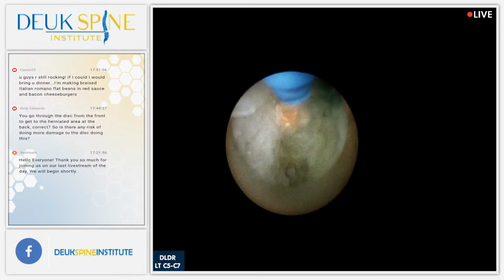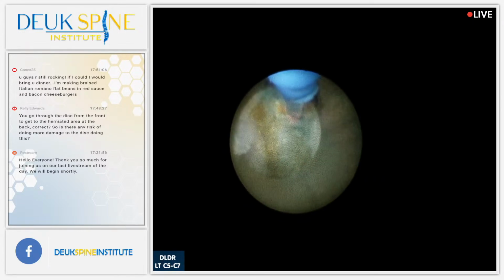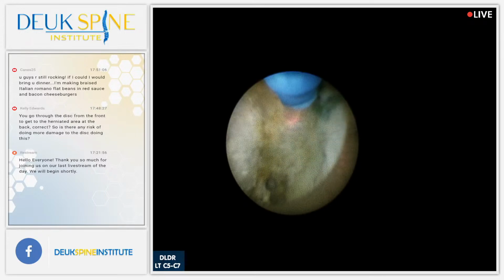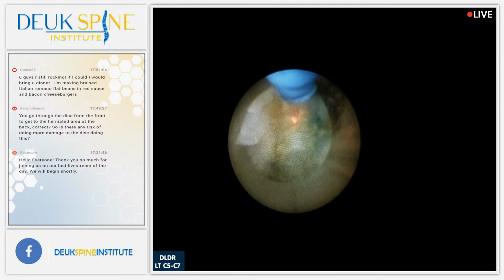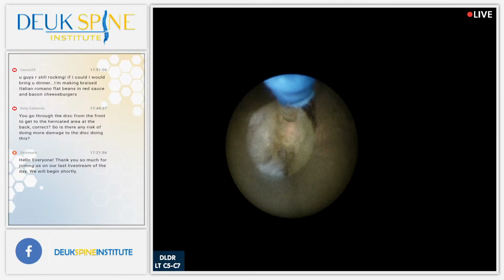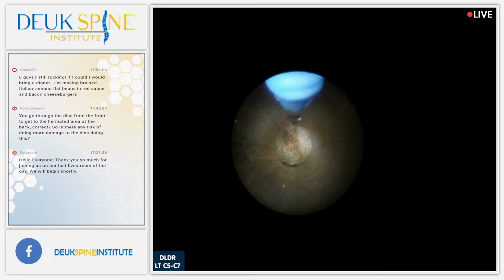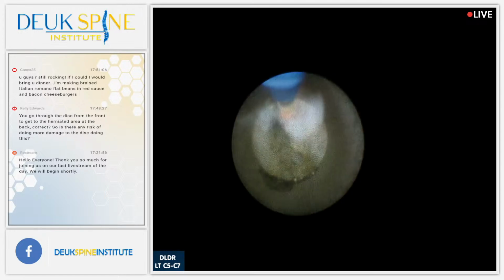And of course, behind the annulus is what's called the posterior ligament. And that posterior ligament, I apologize, those fibers, you can kind of see them right there, are the last of the posterior ligament fibers. And the herniation usually doesn't go through the ligament. It stays to my side of it, with the disc side of it. But in this case, it went through the posterior longitudinal ligament into the epidural space. So most herniations are what are called subligamentous.